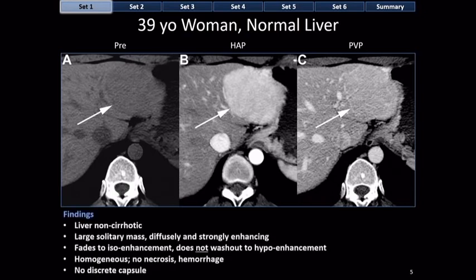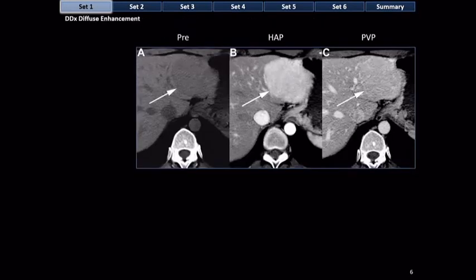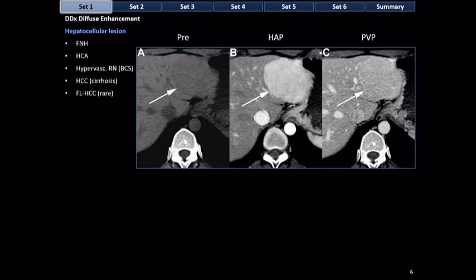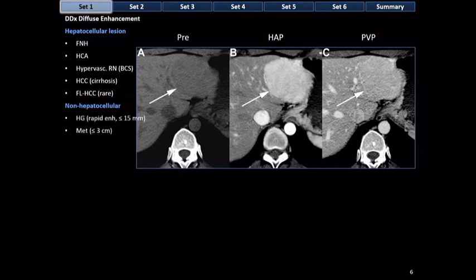The differential diagnosis for diffuse arterial phase enhancement: far and away, you should think a hepatocellular lesion — focal nodular hyperplasia, hepatocellular adenoma, hypervascular regenerative nodule in Budd-Chiari syndrome, HCC in cirrhosis, and very rarely fibrolamellar HCC without cirrhosis. Occasionally, diffusely enhancing masses are not hepatocellular — the differential includes small rapidly enhancing hemangiomas and small hypervascular metastases.